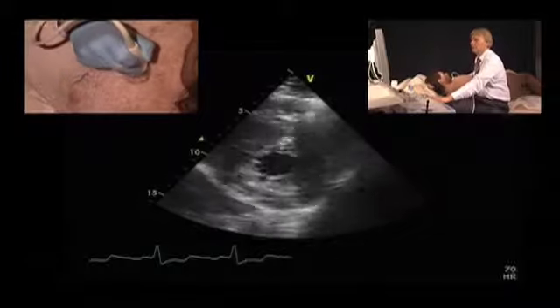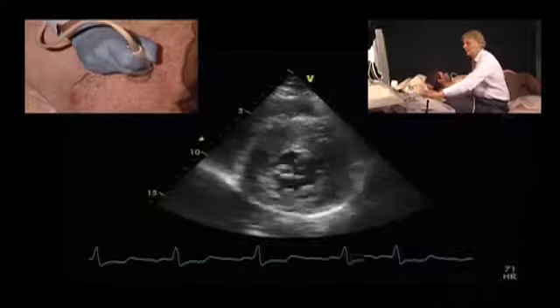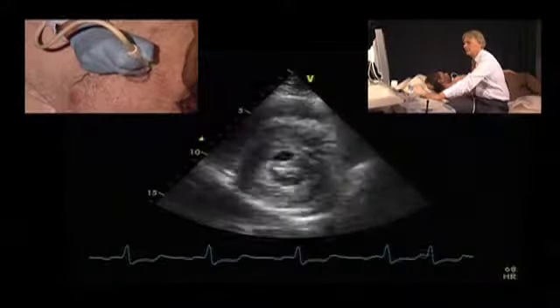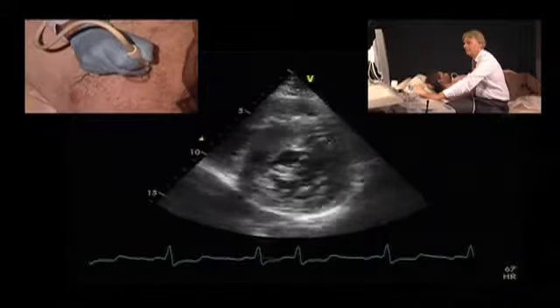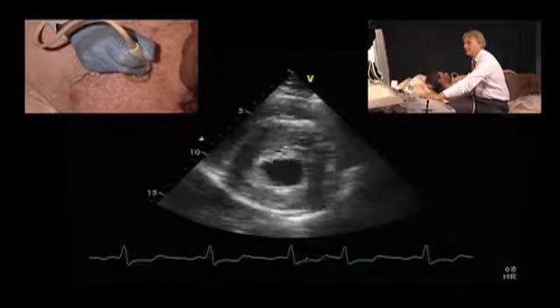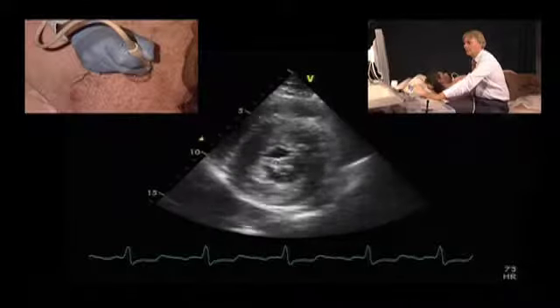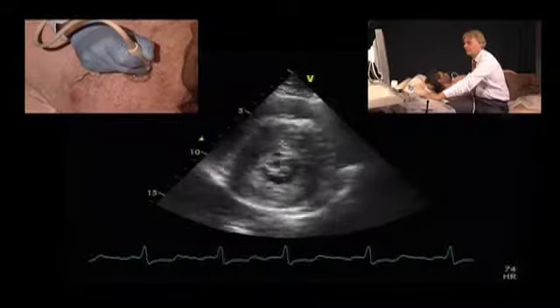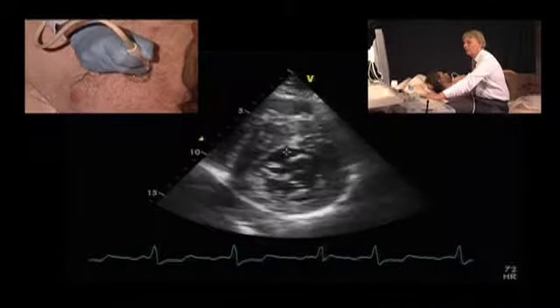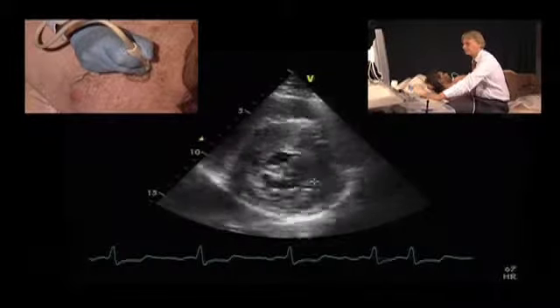Let's turn to the short axis view. In this view, we can see the pattern of left ventricular hypertrophy, with the hypertrophy especially prominent in the region of the interventricular septum, not as much in the remaining portions. We also see here at the level of the mitral valve the SAM phenomenon again, with the systolic motion towards the LVOT septum, and also with motion of the posterior leaflet, which follows the anterior leaflet. So there's a distortion of the mitral valve.